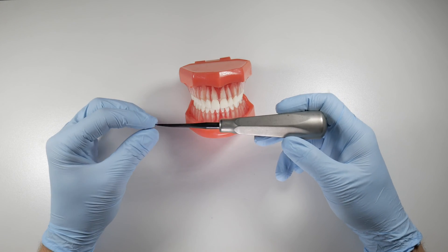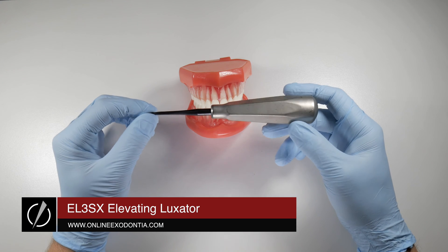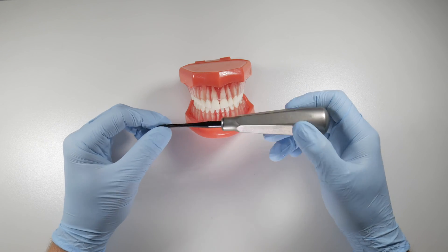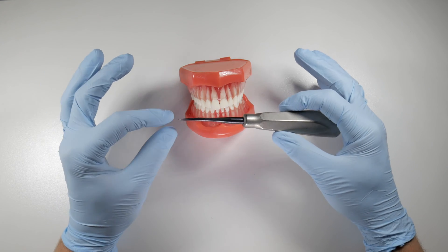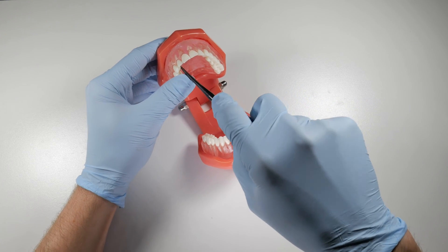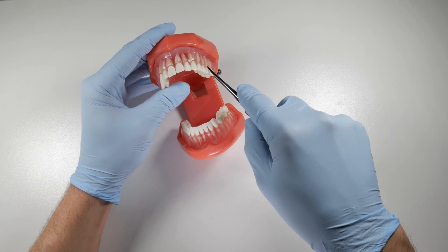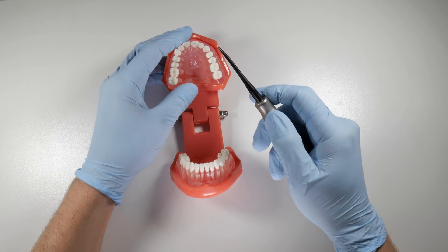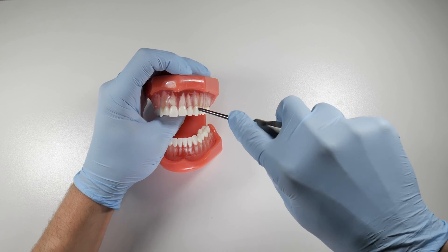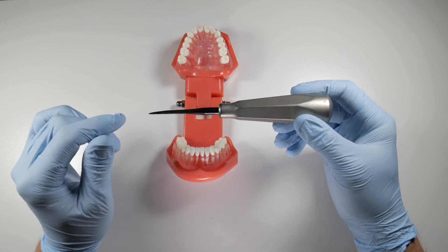In my hand is a luxating elevator. This may be a new concept to some of you, but something you should definitely look into and consider trying. It's a hybrid instrument — it can be used like a luxator and also as an elevator. Luxators are thinner-edged instruments that can be forced apically down the long axis of a tooth to help free it from the PDL and displace it from the socket. It can be used in all areas of the mouth working vertically alongside the tooth, as well as on the mesial or distal aspects. It's a two-in-one instrument.